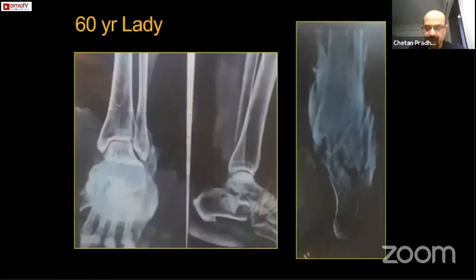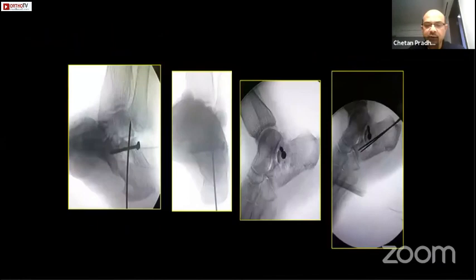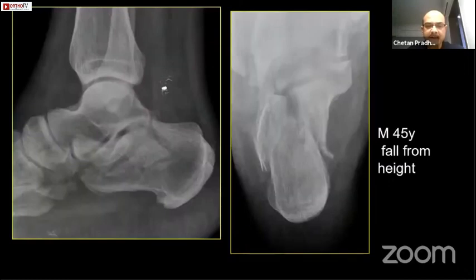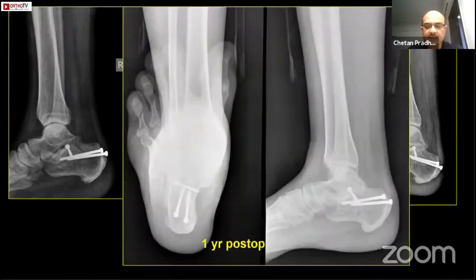One case I wanted to show with the sinus tarsi approach — it has been discussed already, but what I do is I use these cannulated cancellous screws instead of wires. I correct the heel varus using two K-wires, and through the same guide wires I pass these screws. Since I have not used a plate, I would give a cast for six weeks and then start mobilization. Another example of a comminuted facet — here I have used four mm small screws. This is at one year post-op.